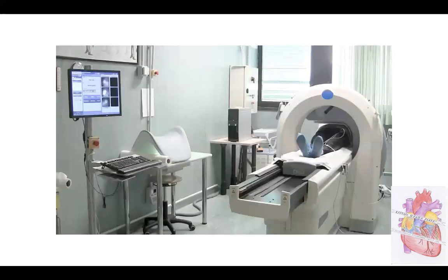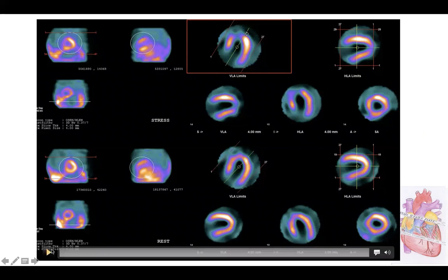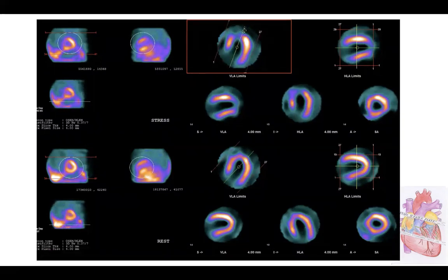This is the scan that we acquired with our camera. We started our acquisition after stress after 15 minutes from the tracer injection in order to be very close to the ischemia time. As mentioned before, we now need to reorient the slices at the end of the acquisition.